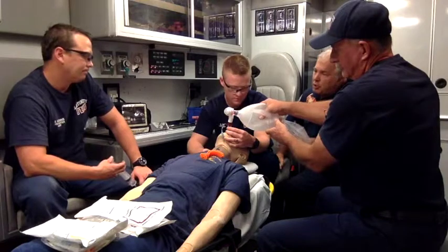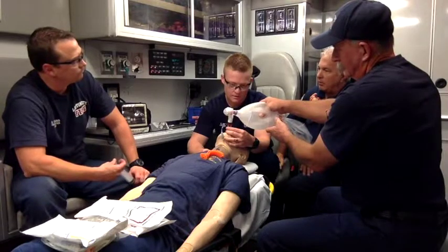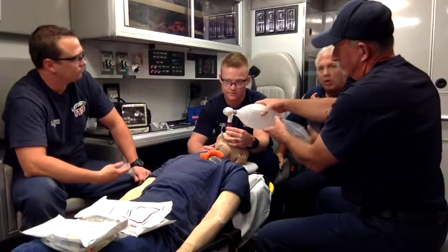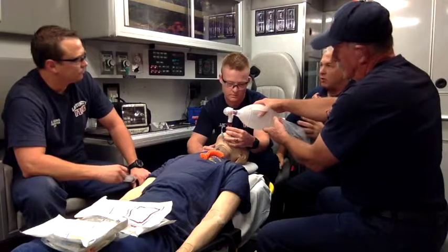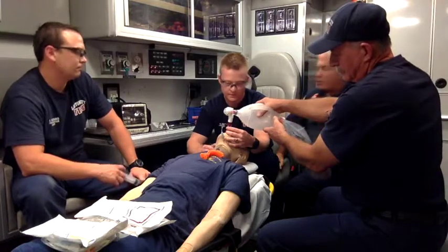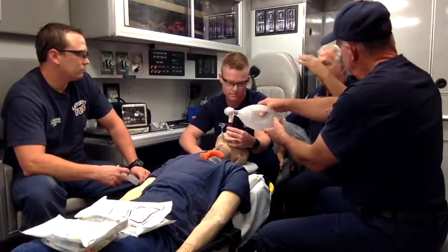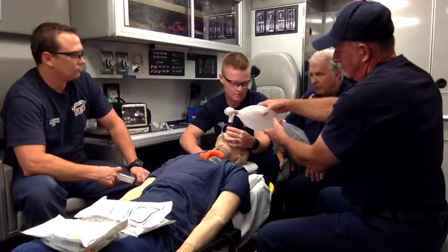And what would you guess I would say is the number one thing we have to do to not lose a tube other than tie it down? Keep one person on airway. Right. And even more than that. Calm, coordinated effort. Calm down. Yeah. Coordinated movements. Once we're getting somebody ventilated, as long as we're managing all the other things that we have to manage, the crisis is over. We're oxygenating now. We're ventilating now. We're not at risk of aspiration, at least significantly less risk of aspiration. Now's the time to get everybody to calm down, because we don't want to take what may have been a really tense situation and make it bad again or worse again because we did something stupid just because we didn't calm down, right?